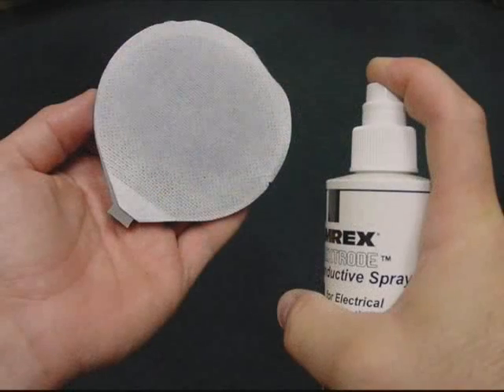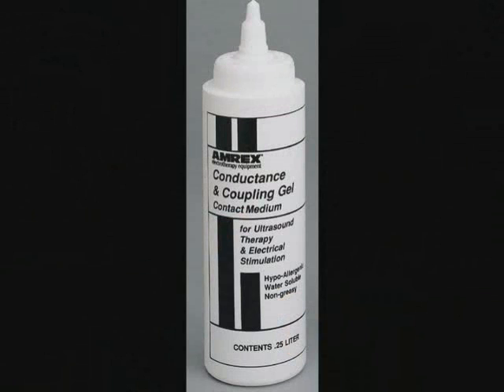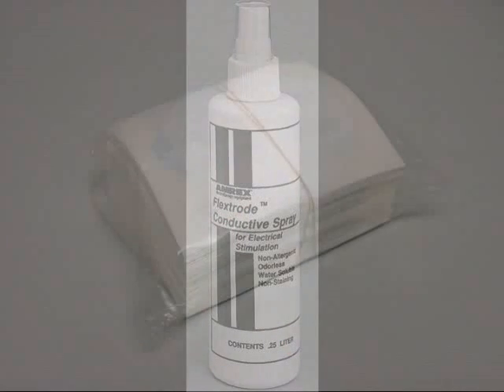The treatment site and electrodes should be cleaned and properly prepared prior to application of electrical stimulation to the patient. We recommend that you use AMREX conductance gel or Flextrode conductive spray and cloth covers to thoroughly moisten the treatment site and electrode surface prior to every treatment.